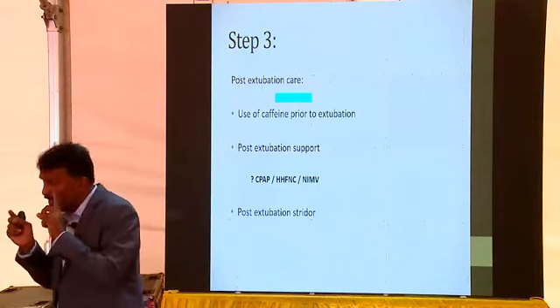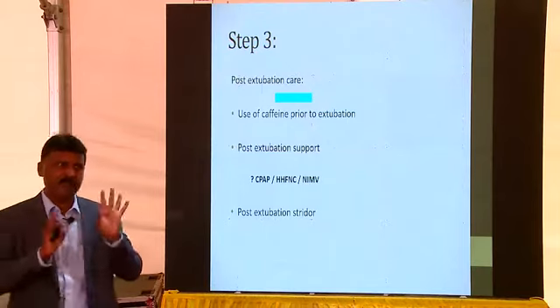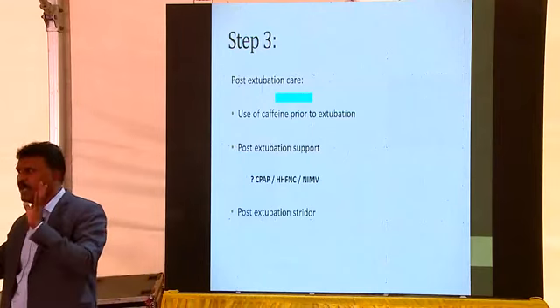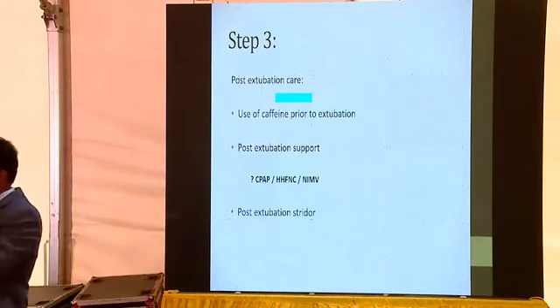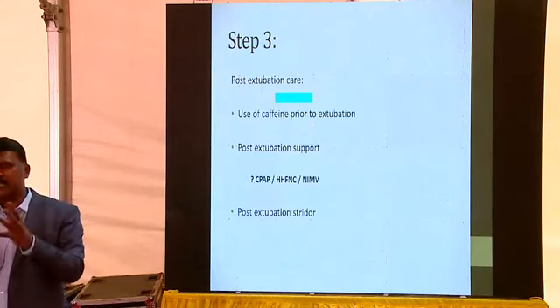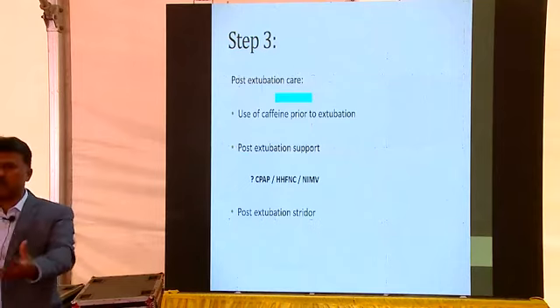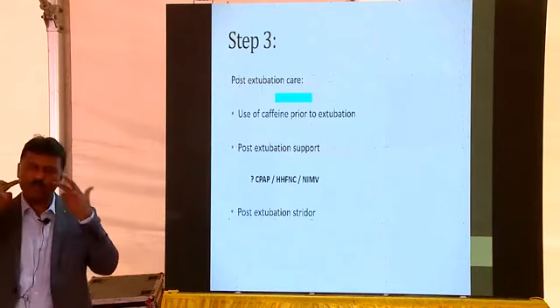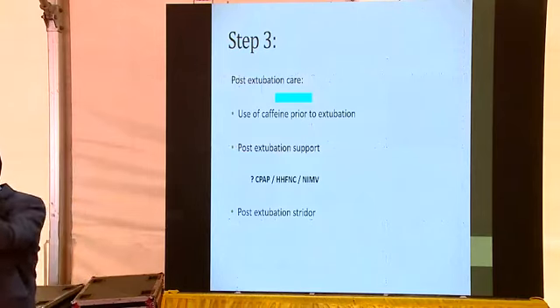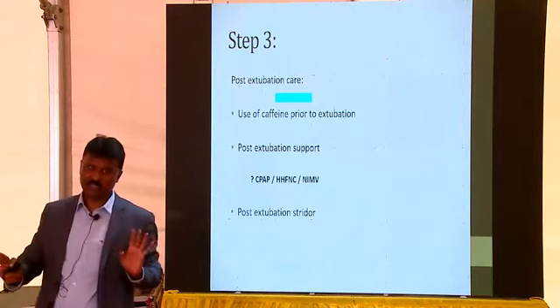HFNC post-weaning has been found to be as effective as CPAP. As a primary mode, HFNC or HHFNC has been found to be as effective as CPAP. So you have a choice. HFNC is easier to operate and looks much simpler. Nurses love it because the mother can handle it, and there are no cumbersome tubes being fixed. Can it work as effectively? The evidence is yes, and my experience also.